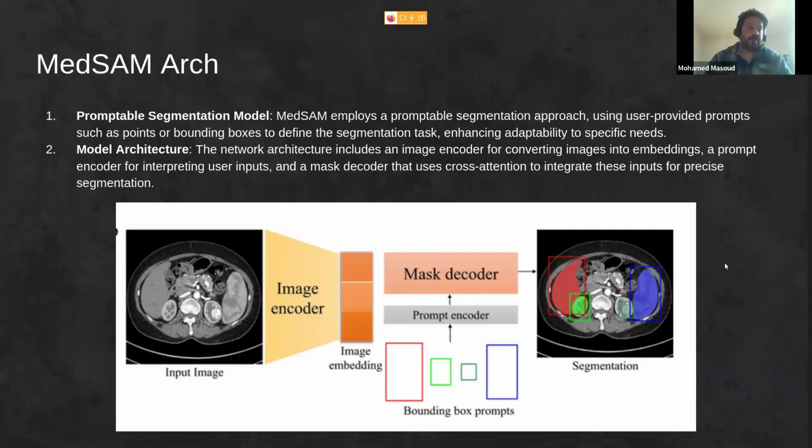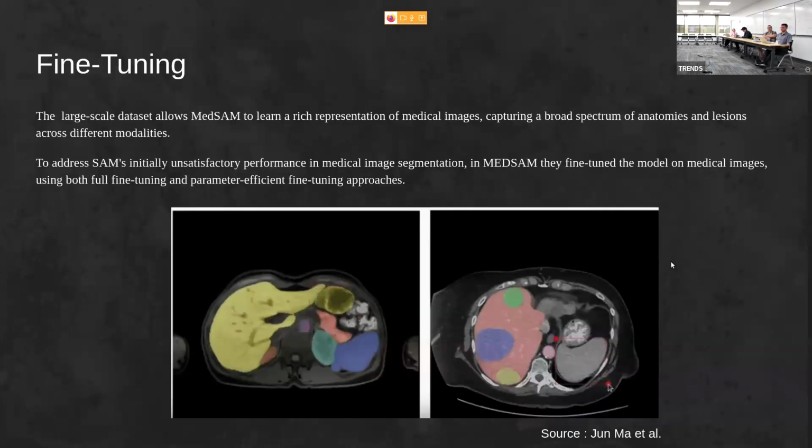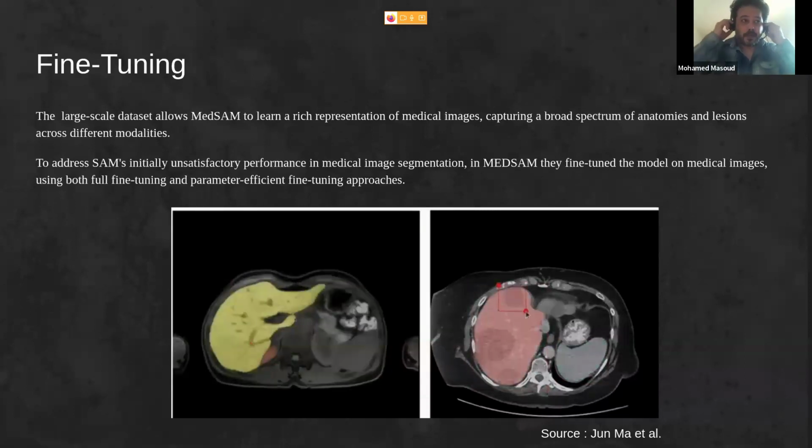The architecture of the... what was going on in that previous slide where there's some user involvement? It looks like they're drawing a bounding box and segmenting only in that region or something like that.